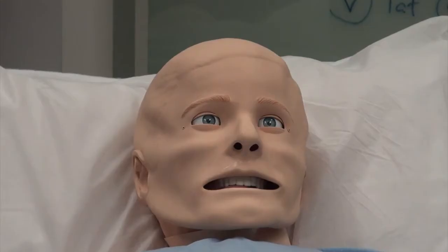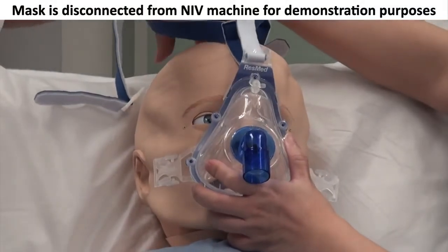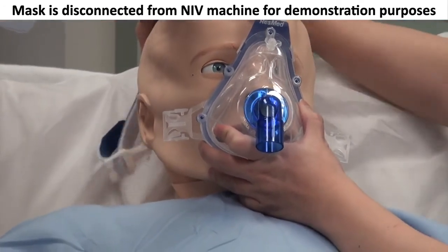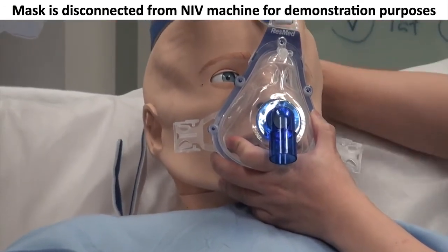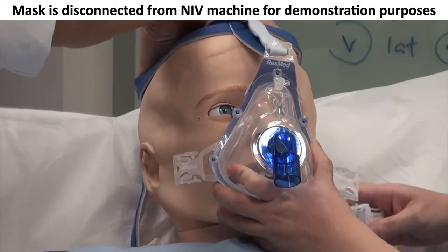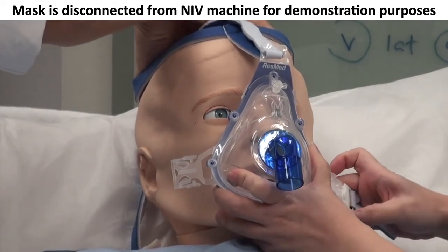I will now go through how to put the NIV mask correctly on the patient and to adjust it properly. This is how you put on the mask. You place it against the patient's face and then you loop it over the patient's head. Get somebody to help you to lift the patient's head up. And then once you have adjusted the position, you can clip and clip the other side.